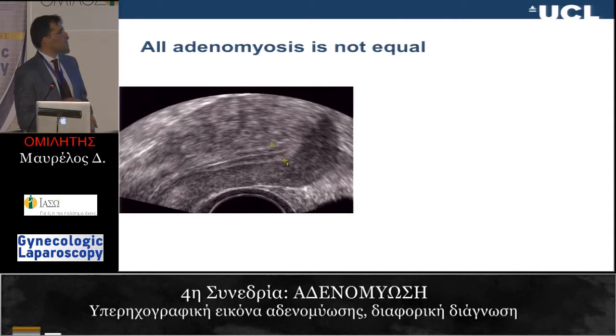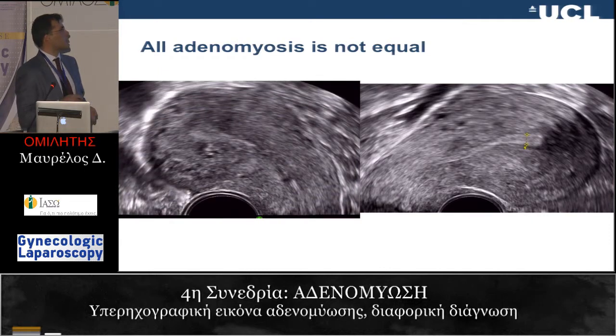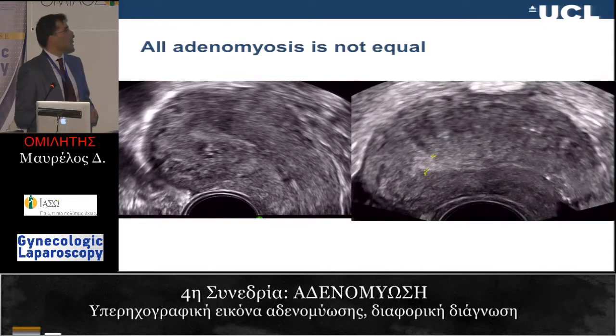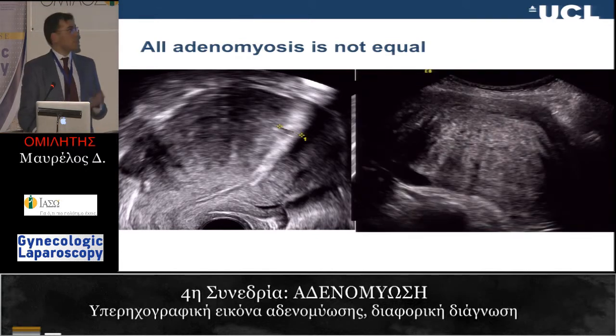So here is an example. We said asymmetrical thickening of the myometrium. There's one, there's another. This looks a little worse. There's a little stria here. There are cysts. And again, these are the stria we talked about. And then here's another one. See, the posterior myometrial wall is much bigger here, and there are cysts, and there are stria. And this is the initial picture we started from. So you can make a diagnosis of adenomyosis by seeing one of these individual ultrasonic criteria.